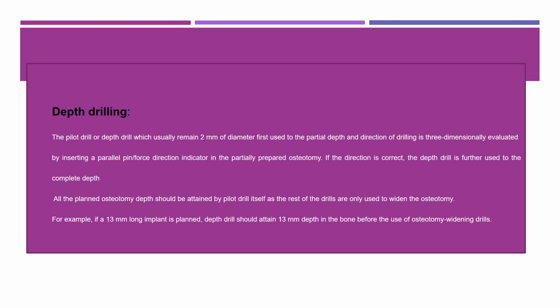After taking the initial drill, if you see that it is misplaced or not in the correct direction, you can use a Lindemann drill or lateral cutting drill. It will be 2 mm in diameter, and that side cutting drill can be used to redirect to the correct position.